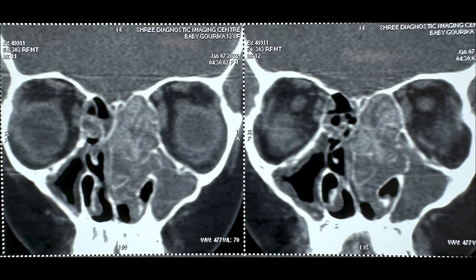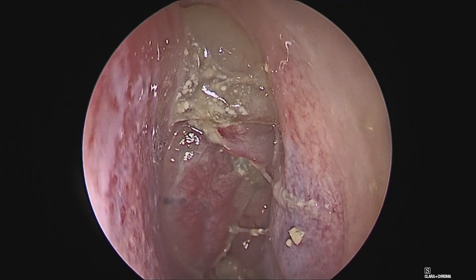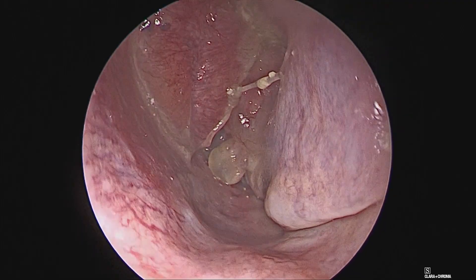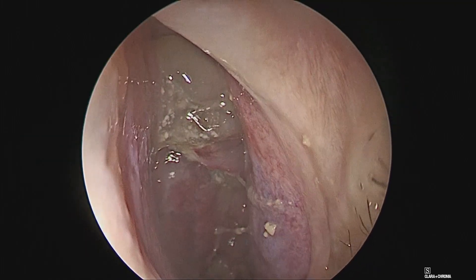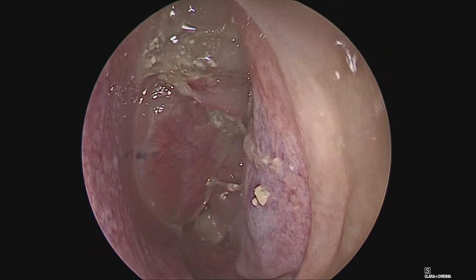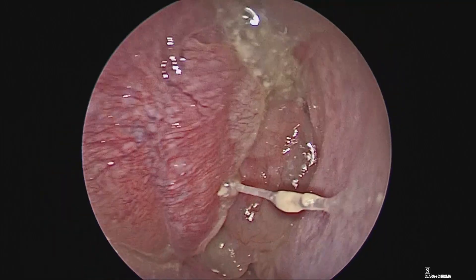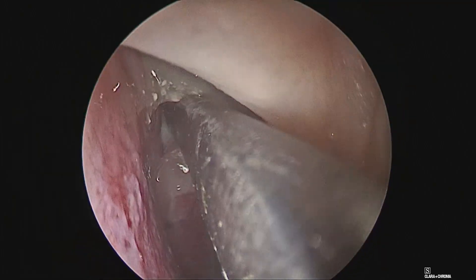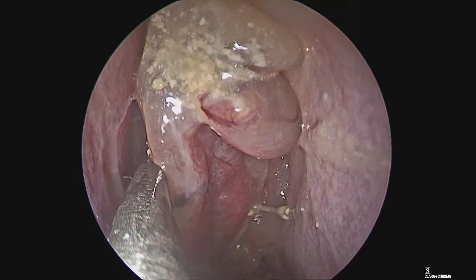There is considerable pressure on the orbit as well, with signs of focal erosion on the left side of the lamina papyracea. As we go endoscopically inside the left side, we see that typical fungal mucin picture which is sometimes chalky and organized, while sometimes it is a more thick fluid which is very mucinous in nature.